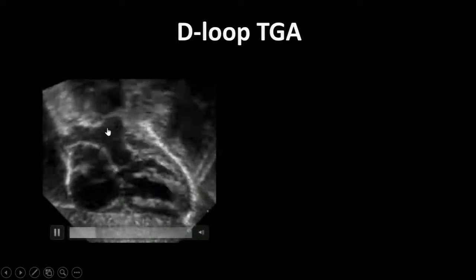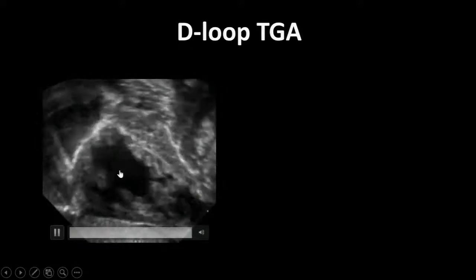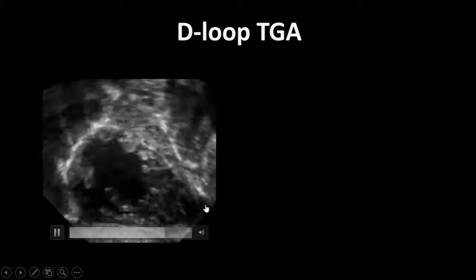So LV going to the PA, similarly you have the RV going up to the aorta, and you get a little clue that it's the aorta, because if you look closely, you can see a little coronary artery coming off over here. So transposition from a subcostal view.